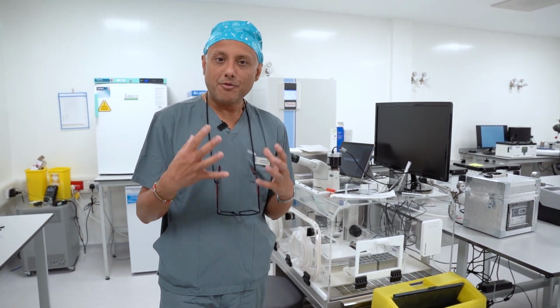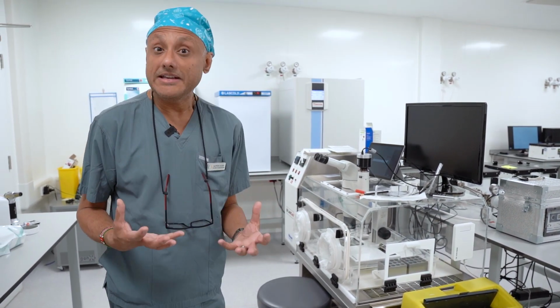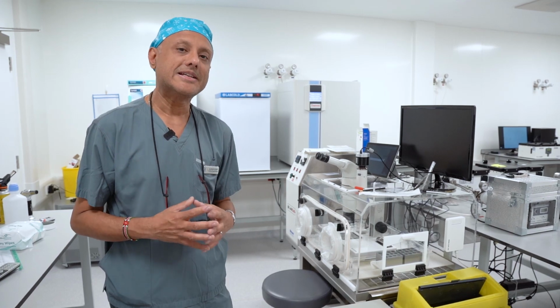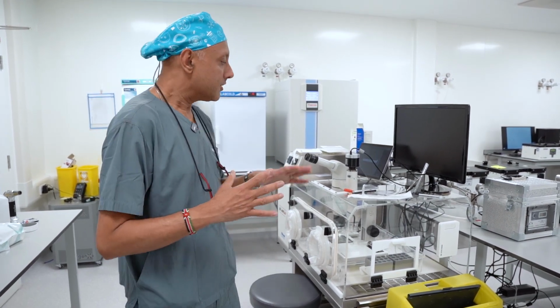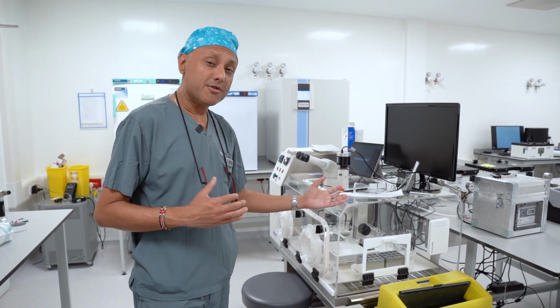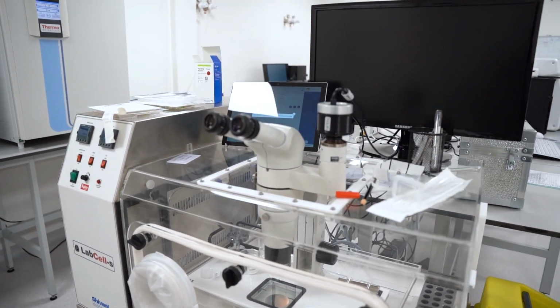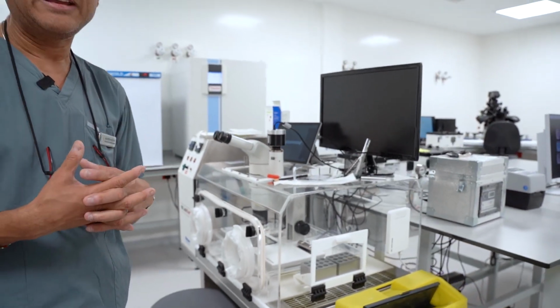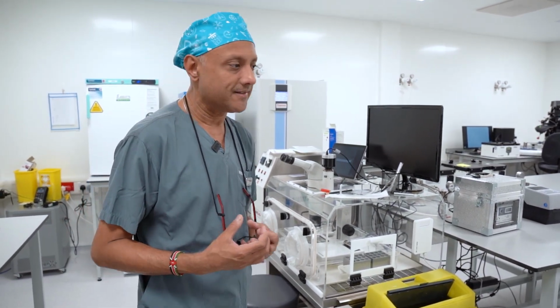and attention. And one of the ways we provide them with this very natural care and ideal conditions is by providing the temperature around the embryo at around 37 degrees, because that is the body temperature, and that is the temperature that the embryos are constantly wanting to be under. So that's why we use chambers like this, which is not routinely used in any other IVF clinics, but we have adapted to this closed working technology in order to make sure that the eggs and embryos are constantly under physiological conditions and there is very little trauma that the embryos face.